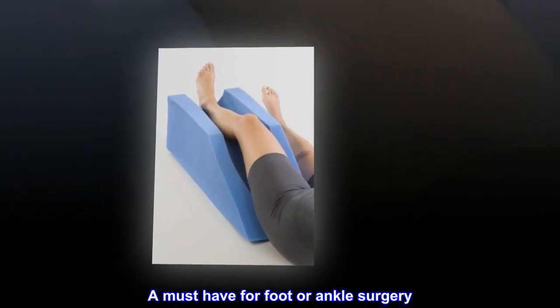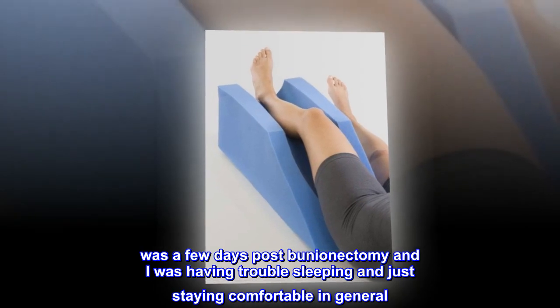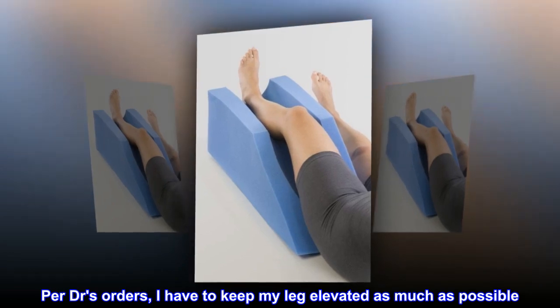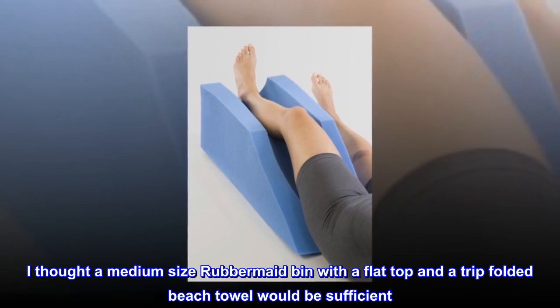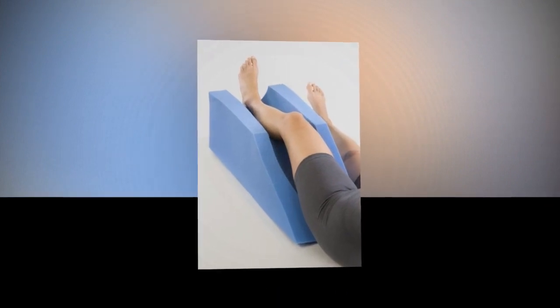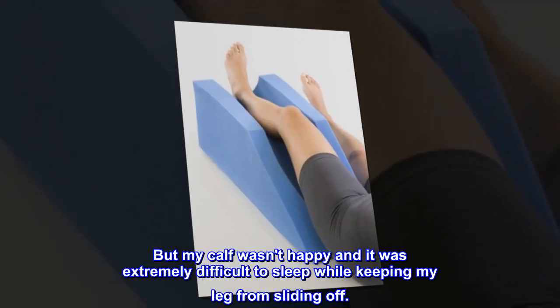Top reviews from the United States. A must-have for foot or ankle surgery. Was a few days post-bunionectomy and I was having trouble sleeping and staying comfortable in general. Per doctor's orders, I have to keep my leg elevated as much as possible for six weeks. I thought a medium-size Rubbermaid bin with a flat top and a tri-folded beach towel would be sufficient — it was okay — but my calf wasn't happy and it was extremely difficult to sleep while keeping my leg from sliding off.